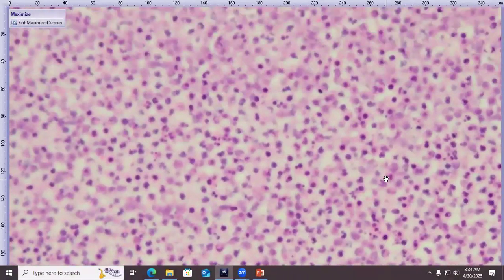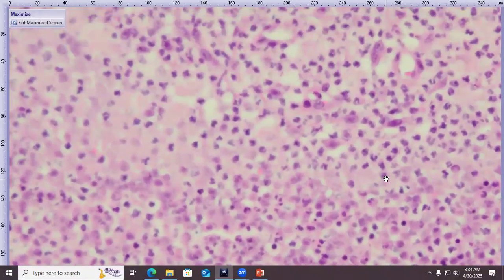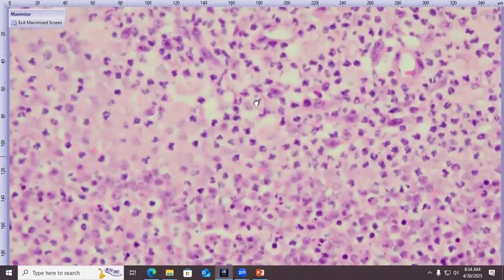Let's just walk slightly back to where we were. So kind of seeing a little bit of that fibrovascular nature here of the lining, macrophages and neutrophils in a central cavitation after that. So this is classic abscess. We have a cavitation full of pus and lined by fibrovascular tissue.